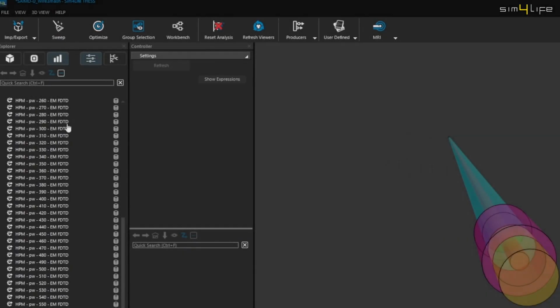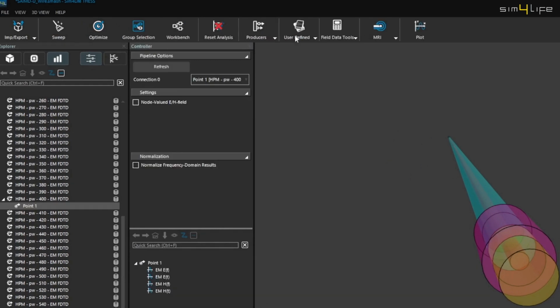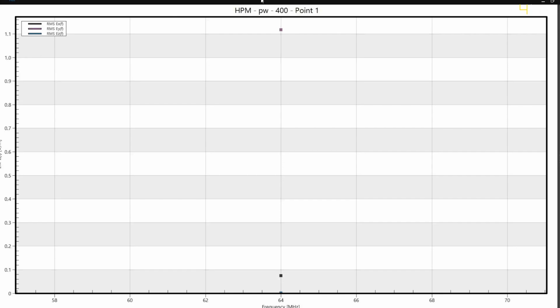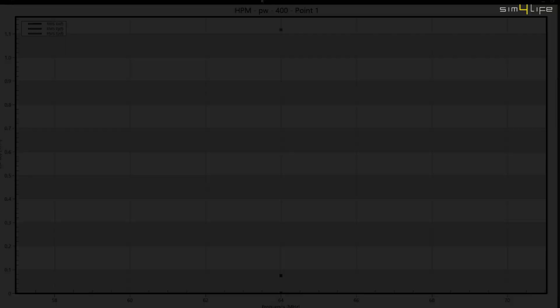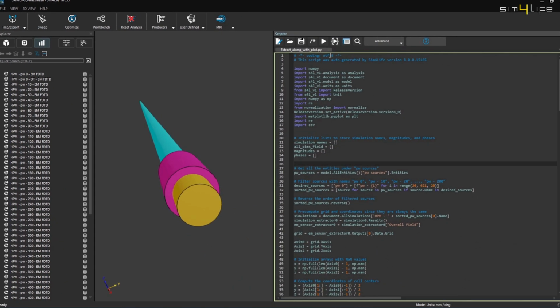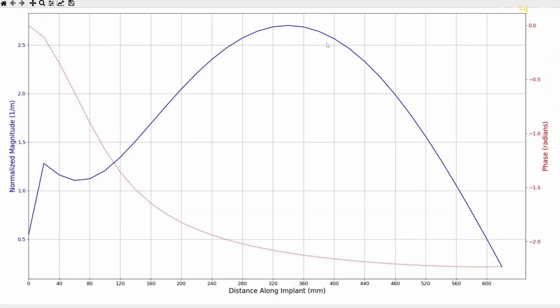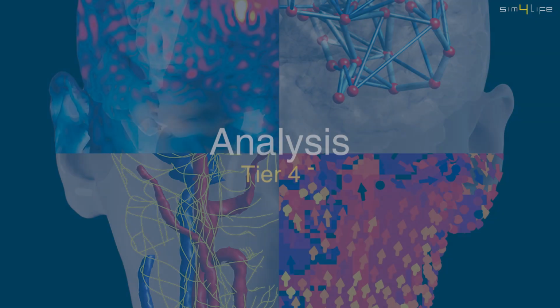Now that we have completed all the required simulations, it's time to gather the results and derive the numerical transfer function of the implant. We now move to Scripter to extract the complex scattered electric field component from the point sensor of each simulation. The total magnitude and phase components are normalized to the length of the implants in order to plot the transfer function.